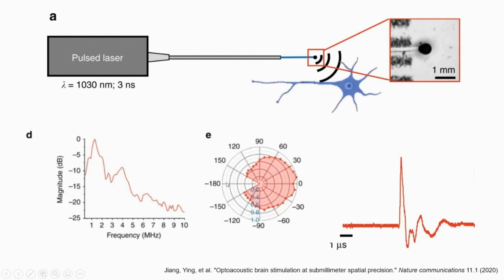And here's, I forget what they call these diagrams, but basically this shows you relative to the front of the epoxy, which is at 0 here, the red shows how much we're getting out of the front versus in reverse, which would be 180. So most of the pressure is being pushed forward, but you get this omnidirectional sort of field.